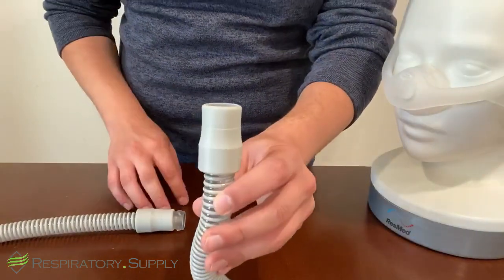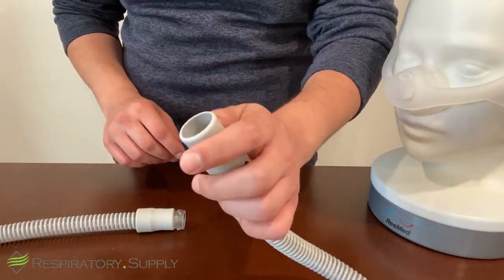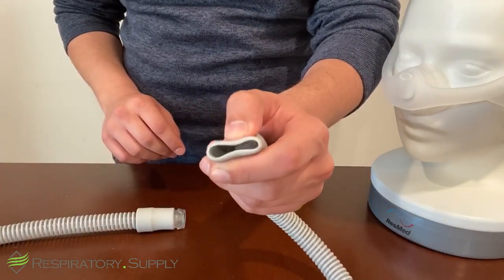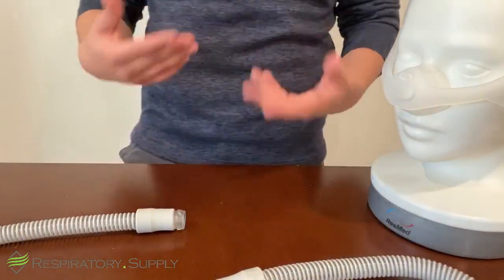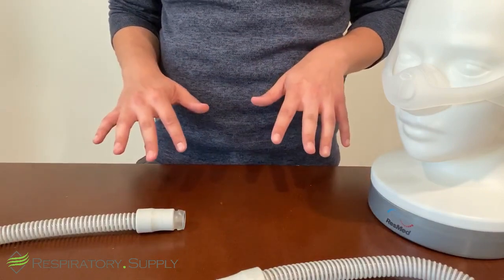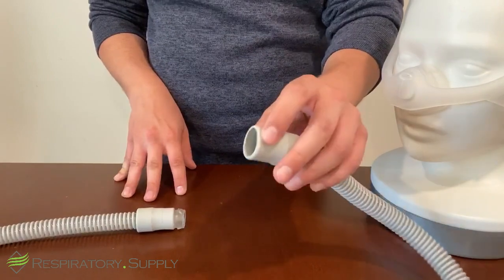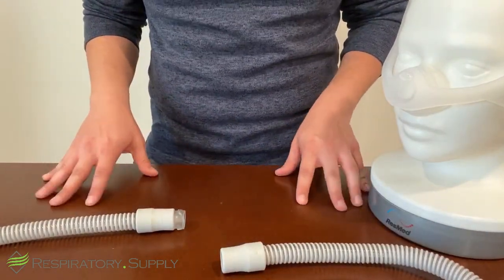But a tubing without any connector, you can see here, is just rubber. There's really nothing at the top here, no foreign objects to be seen. If you look down here, you give it a squeeze. This is an excellent indicator that there is no connector in the mask because some of the connectors themselves do match the color of the tubing, so it can make them hard to identify. However, giving it a squeeze so you know that the rubber itself moves and flexes lets you know that there is no connector in there and you are set to attach your mask.